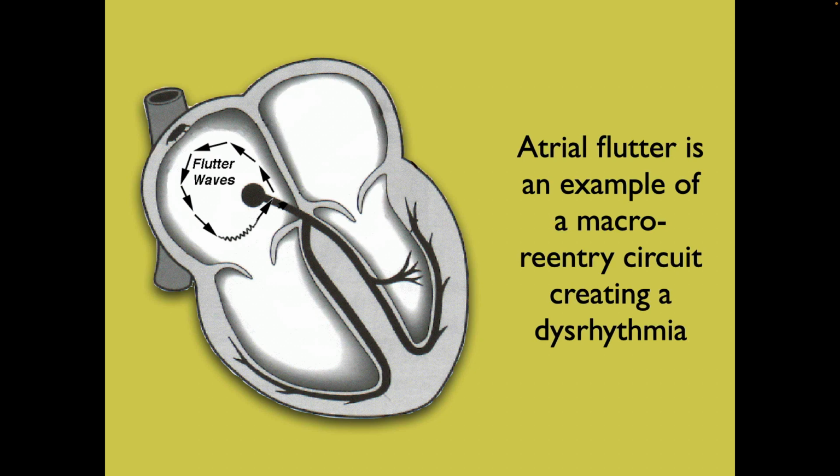Okay, here's a picture. So what happens in atrial flutter is you have a reentry circuit, very rapid. Let's say it's 300 times a minute. And you're going to see, in a minute we'll look at an ECG strip, there aren't true P waves, but they're what we call flutter waves. And they're about 300 times a minute, so really fast, okay? Every time it hits the AV node, there's a chance of it going down the AV node, okay? But the AV node typically is not going to be depolarized at 300 times a minute. It's too fast.